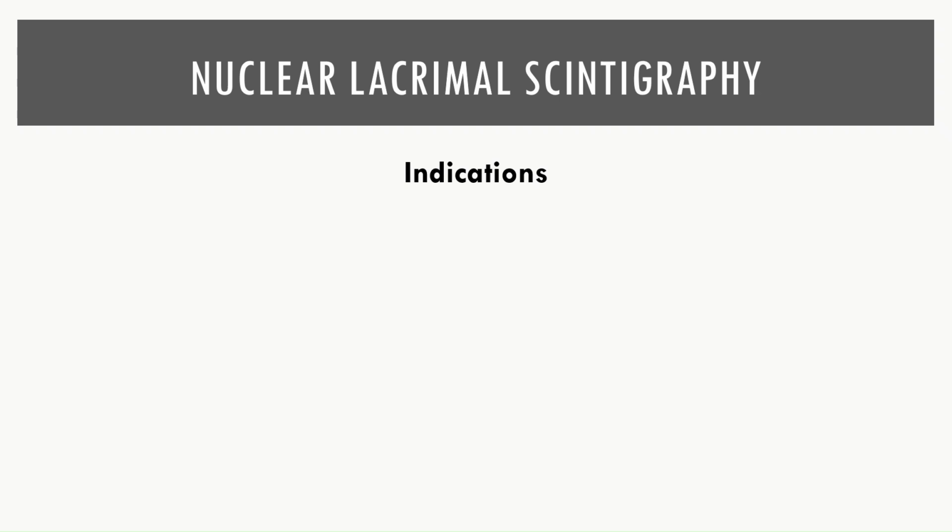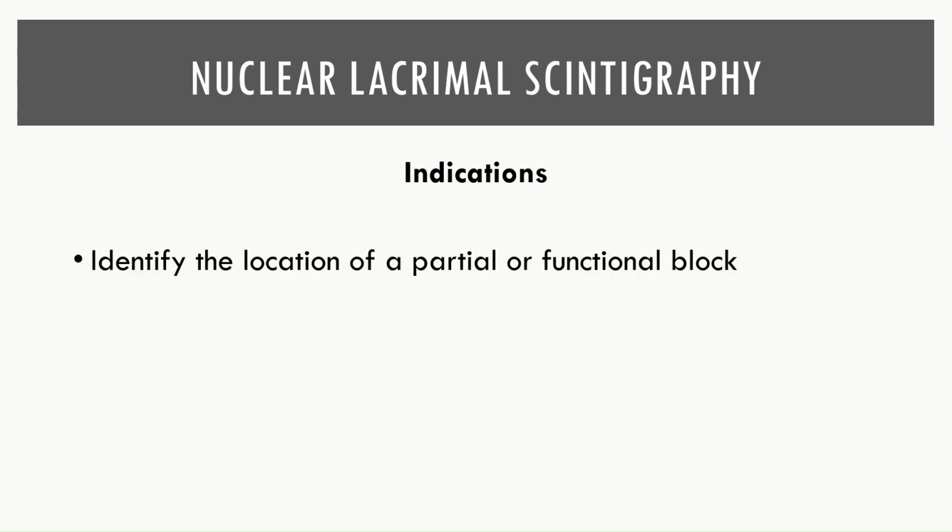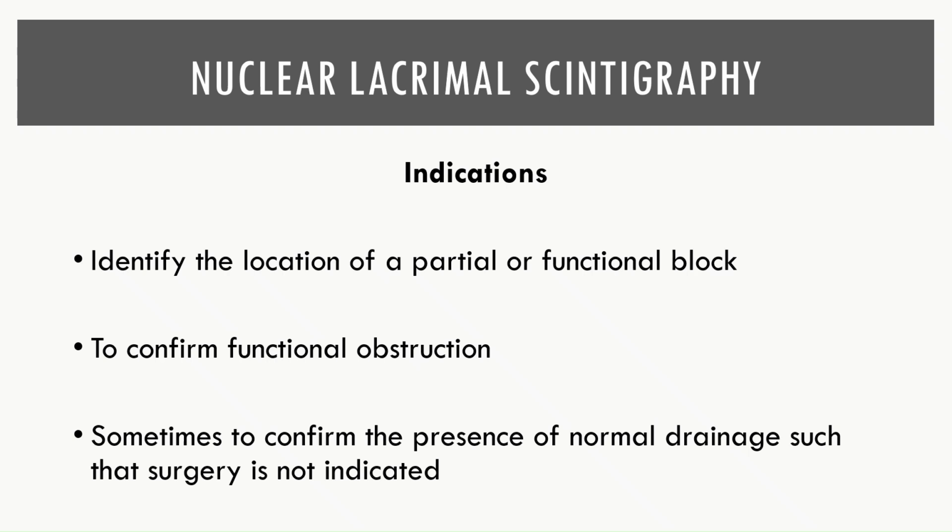It is helpful in detecting functional block and lacrimal pump failure. Sometimes it is also used to confirm the presence of normal drainage such that surgery is not indicated.